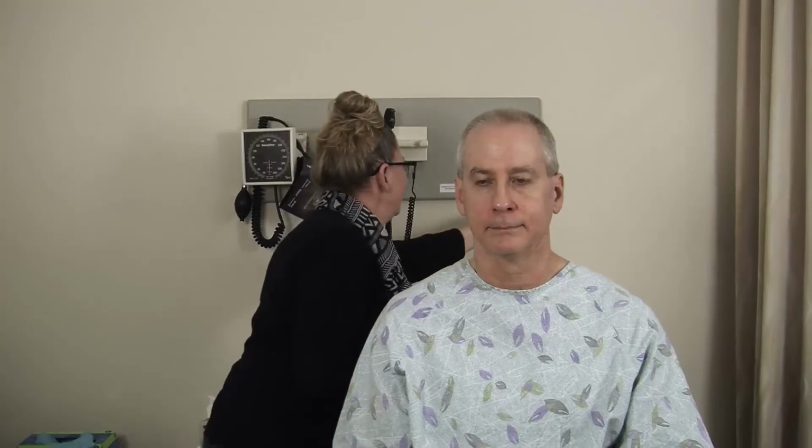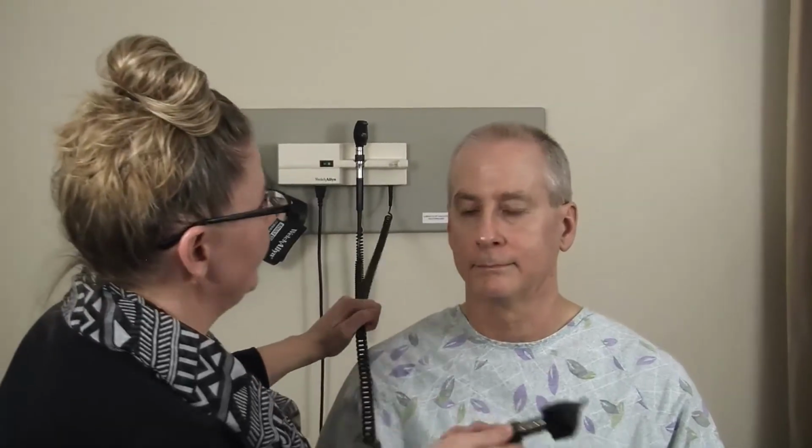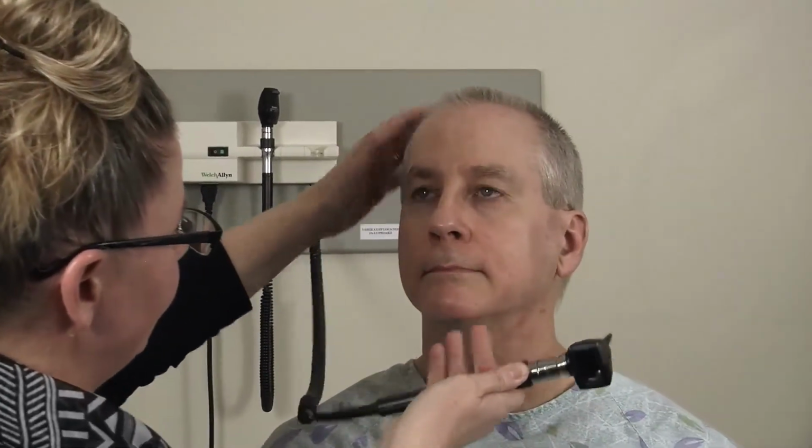Good. All right. The next part of the exam is I'm going to inspect the mucosa and the turbinates and the septum on the inside of the nose. I'm looking for color, alignment, any discharge, any swelling, any perforation, any foreign bodies. So again, I'm going to make the light as bright as possible. I'm going to have him lift his head slightly, and then I'm even going to help lift the tip of his nose and look on in.